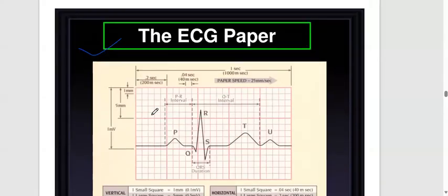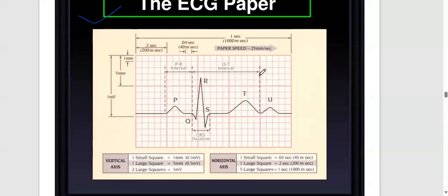Okay. So this is the ECG paper. First we will read the boxes. What are the distances between the boxes and how much distance do we have to remember? So basically, this is one line and this is one line we have.